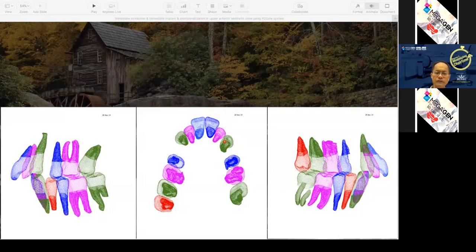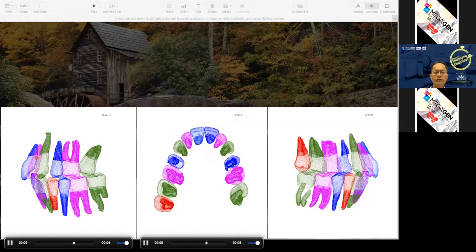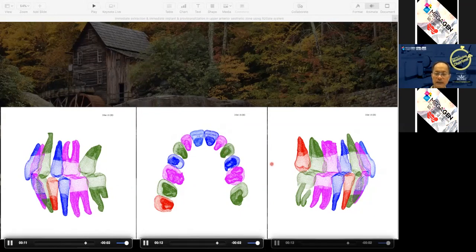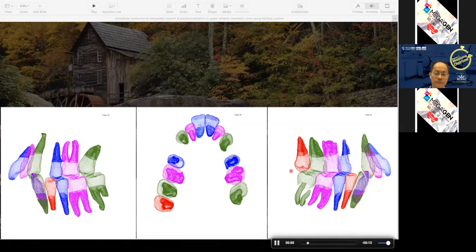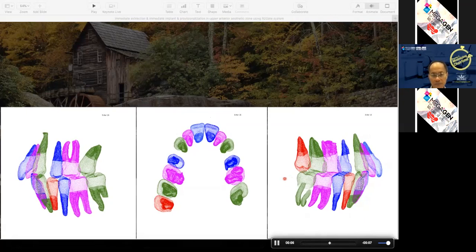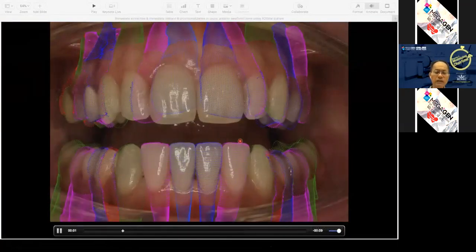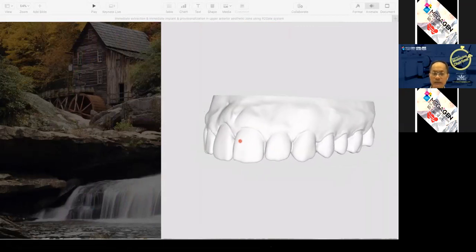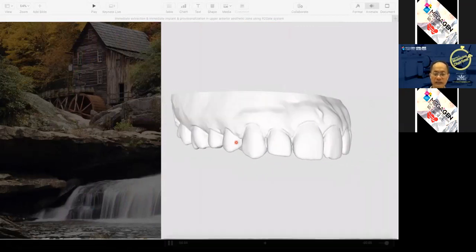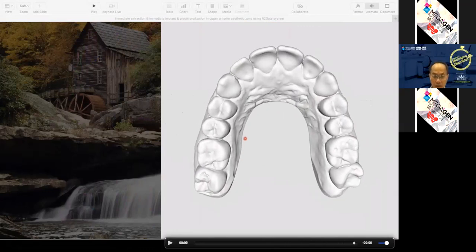I also want to share with you one very exciting future. As an orthodontist, assuming that I were to move the teeth digitally, and at the end of the day, I wish to put the implant, can I, before I start my orthodontic treatment, plan for my implant and also be able to produce the final position? This sounds quite impossible in the beginning, but I can tell you that it is a reality right now for all of us. So as an orthodontist, as well as a dentist and oral surgeon who places implants, I am very excited to share with you this new technology.